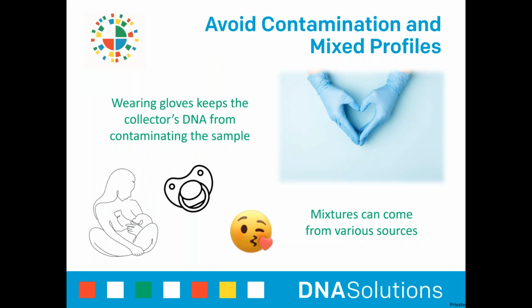Gloves should be worn during a collection, not only for your protection from bodily fluids, but also for your client's protection from any possibility of contamination from you. The goal of every sample is to obtain a single source profile, meaning the profile of just one individual. To avoid contamination and possible mixtures, wearing gloves is your best bet when collecting any sample, including non-standard samples.